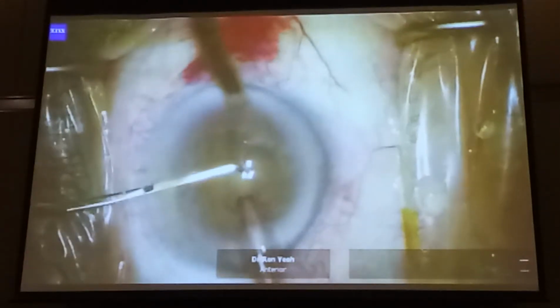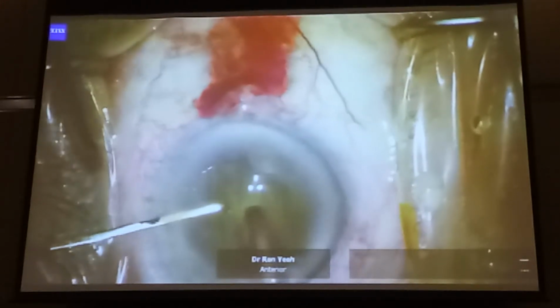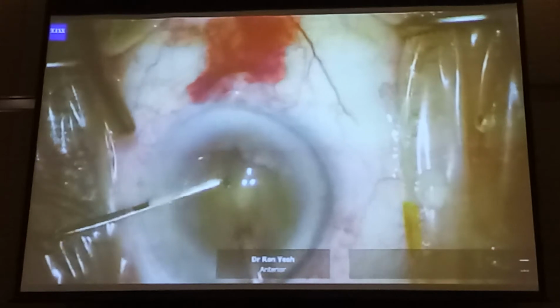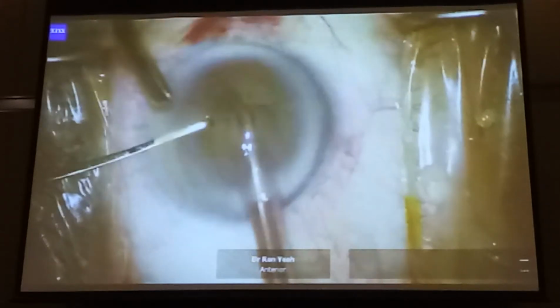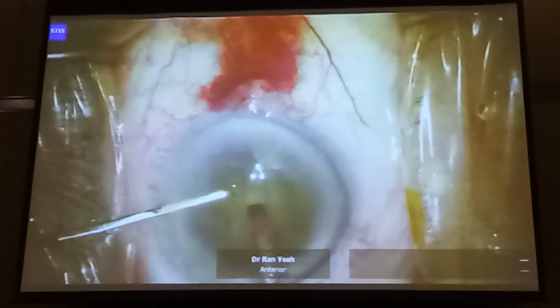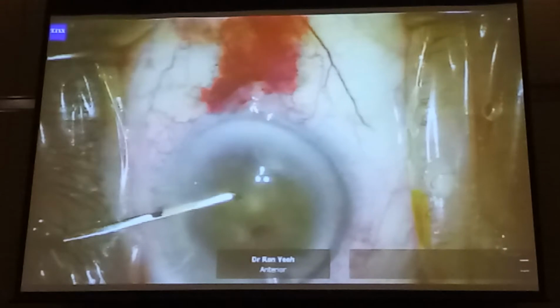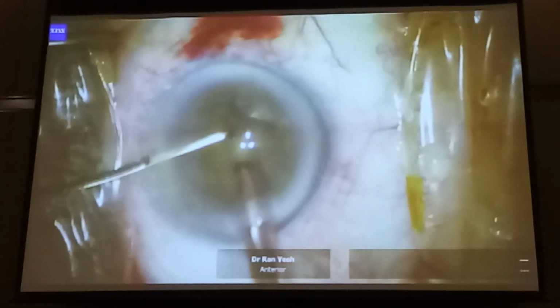And when you try to stop and chop a soft cataract, you're going to groove. And here's the grooving going on. But when you come to crack the soft nucleus, what's going to happen? When you push the 2 nuclear fragments apart, you will see that it doesn't really crack very easily because there's just no resistance to pushing.